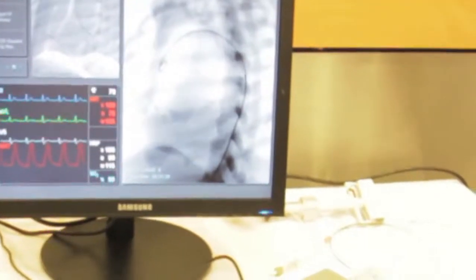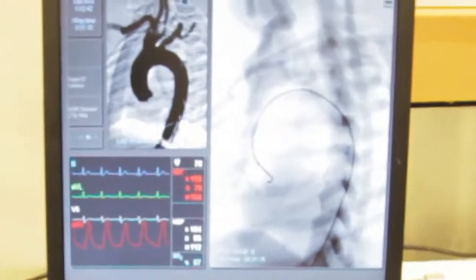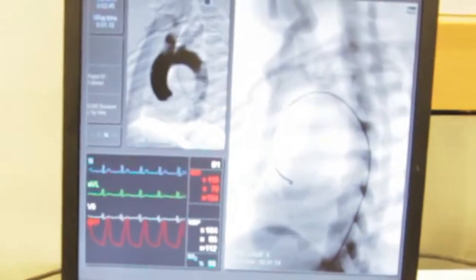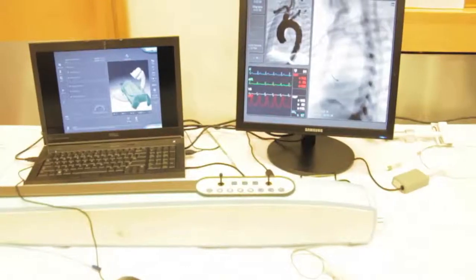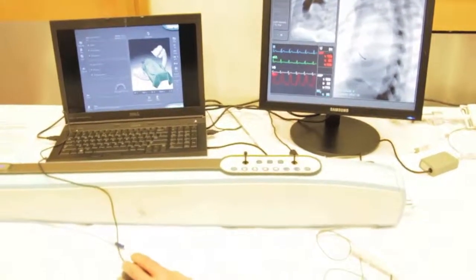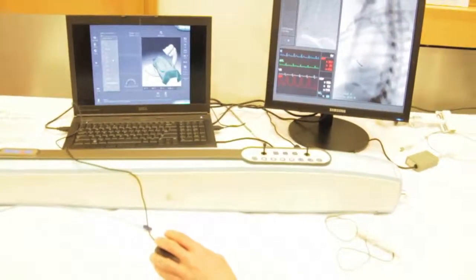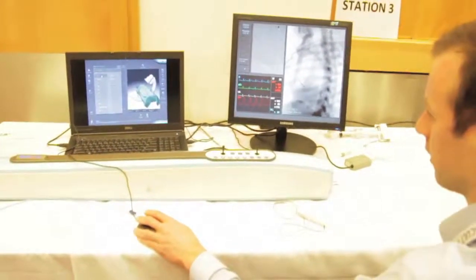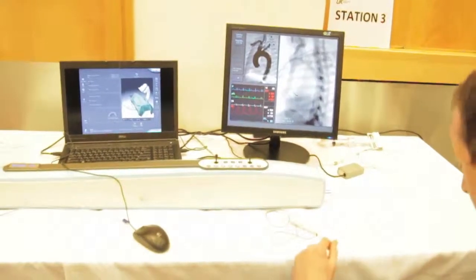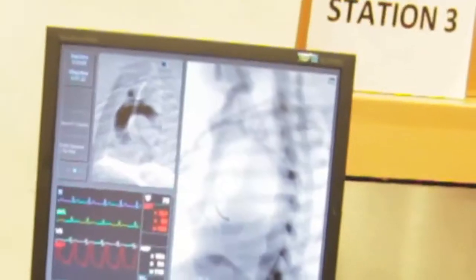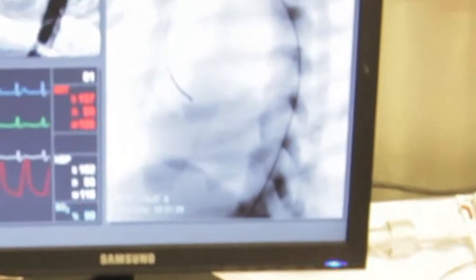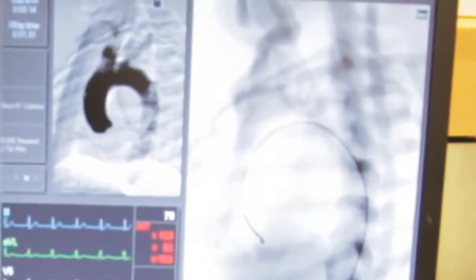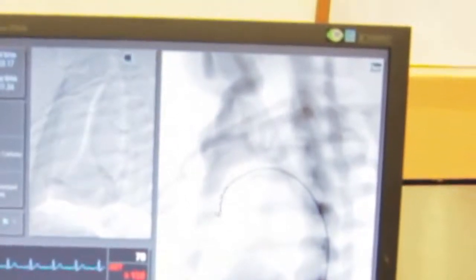We're then going to re-advance the J-tip guide wire in exchange for a catheter that allows us to select the left common carotid artery. We straighten out the pigtail catheter and remove it over the wire — the guide wire should stay in approximately the same position. We then change for a suitable selective catheter; in this case we're going to use the Berenstein. We advance the catheter over the guide wire and will select the vessel by pulling back on the catheter. When we get the catheter past the vessel we want to select, we remove the guide wire.